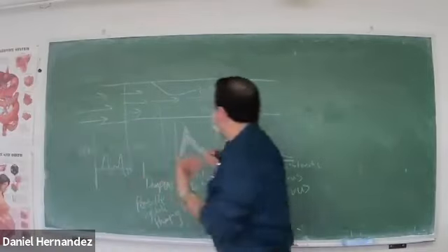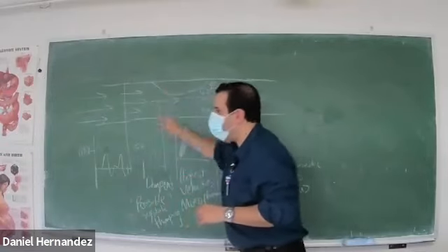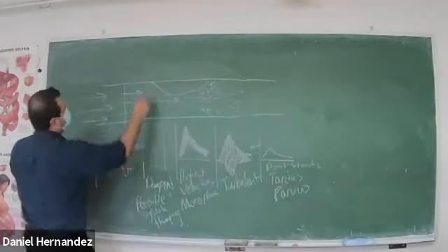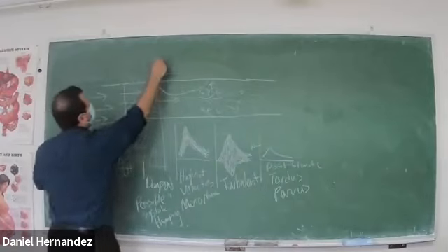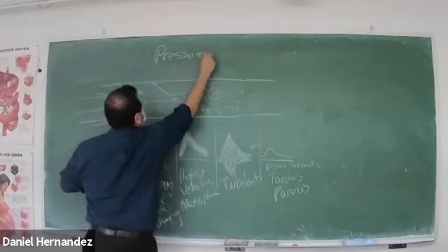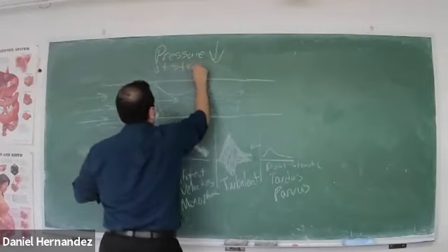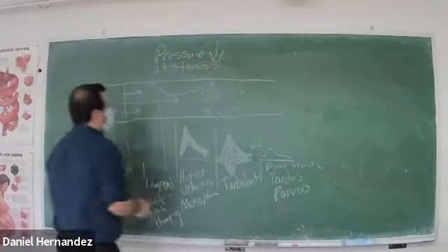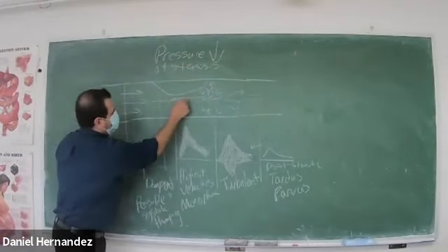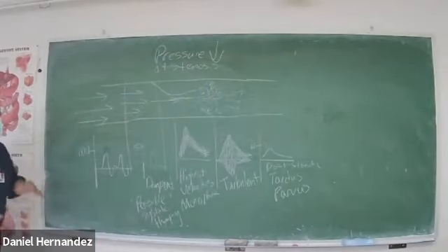As we move closer to that stenosis or blockage, when we start getting the narrowing, that's when we start getting that increase in velocity. So as we approach the stenosis, because of Bernoulli's, pressure starts dropping. Pressure decreases. So as we enter into that stenosis, through that stenosis is where we're getting our highest velocities. So that's when our waveform will undergo those drastic changes.